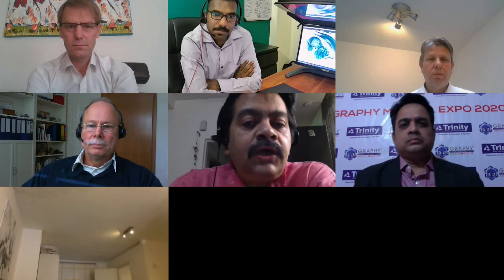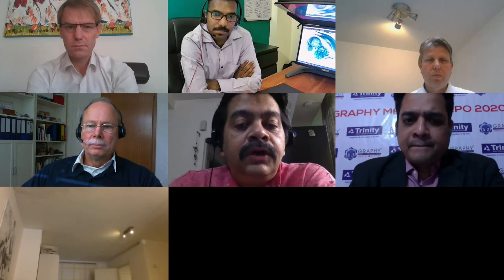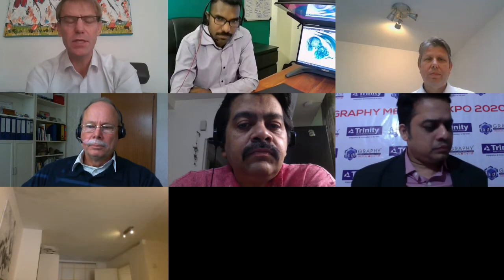So if we have to actually look at the strength of PluraView, do we have a demo piece moving around in India which we can have a look at? We have 5 displays at the moment available in India, and Sri Hari is our representative in India, and he can arrange a demo with you.